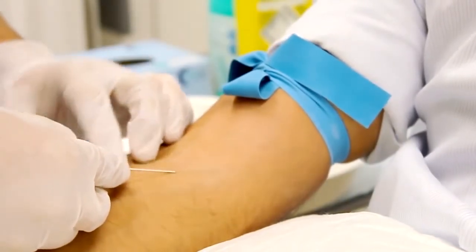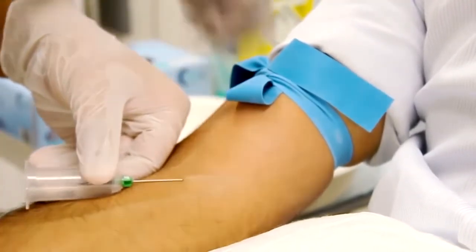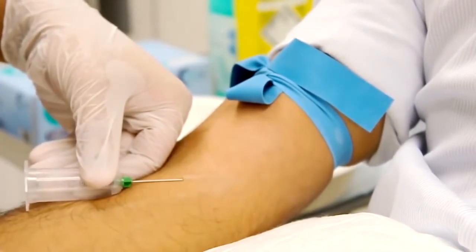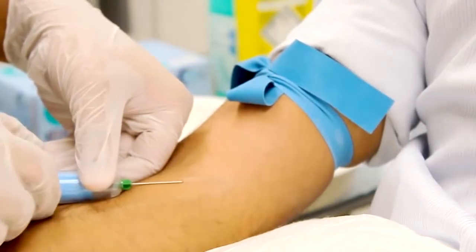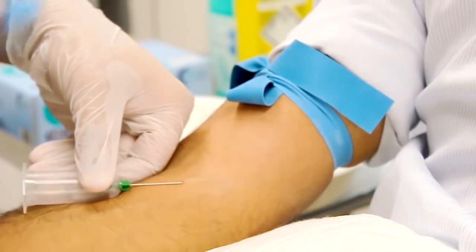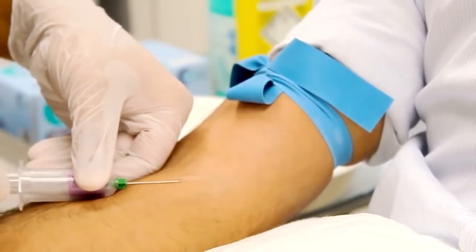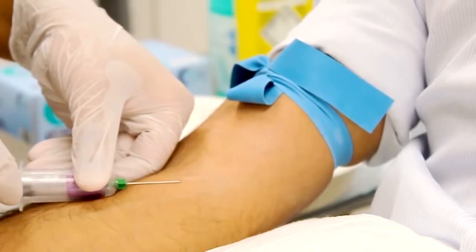As you go into the vein, you will feel it kind of give, and that is your cue to get the blood bottles ready. Start taking your blood. Now, we've accidentally put it on the other side. If you're right-handed, put it on your right side. Make it easier for yourself. Make life easy. And take your blood.